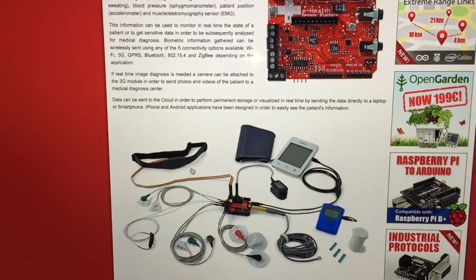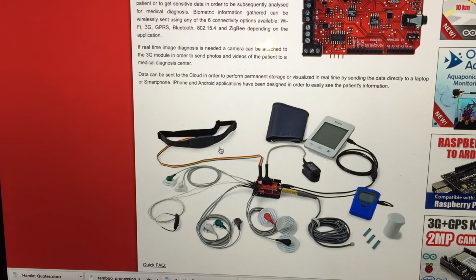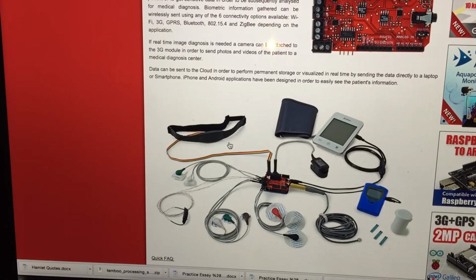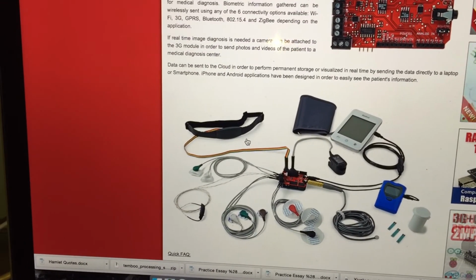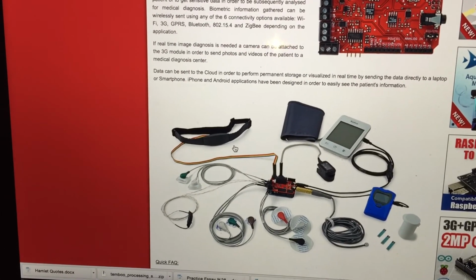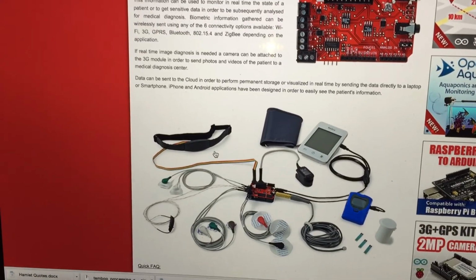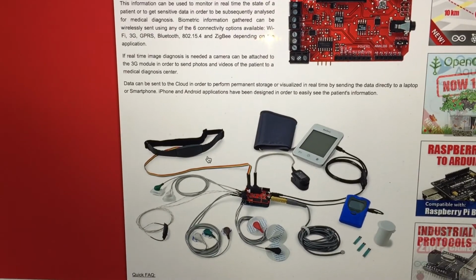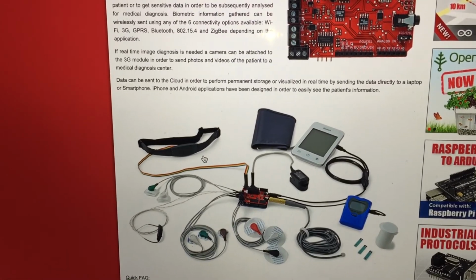As you can see, there are multiple sensors that are attached to the eHealth Shield, ranging from blood pressure, oxygen, airflow, skin resistance, ECG, etc. I have connected a fair few of those. Some of them are currently connected to my body, especially the ECG. I will be breathing in and out on the airflow just to show you the readings that you get across onto the Salesforce platform. Let's have a quick look at the contraption.